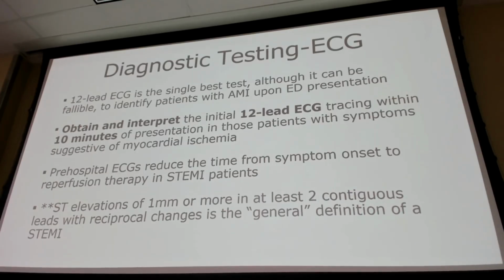Pre-hospital EKGs: depending on where you're at in your EMS system, they may get an EKG initially when they show up at the patient's house, and then they can decide whether they're going to a cath lab and activating it right then versus going to a different facility. So you may have a pre-hospital EKG, and some places can transmit it over to you as well, which is nice.